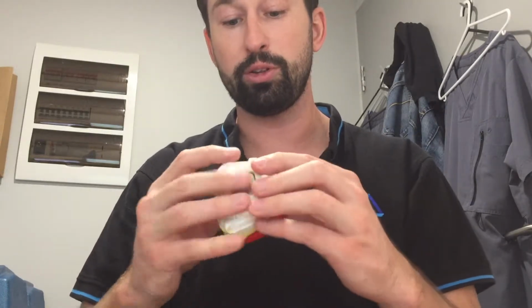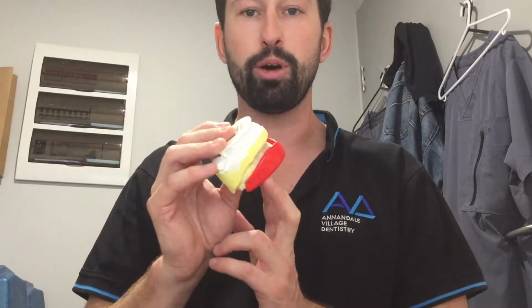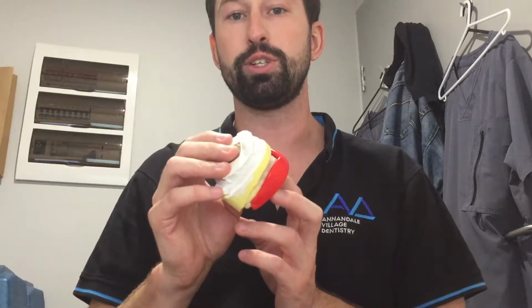Alright, so retention's great. Why is it so great? Well, it holds the mouthguard in place, which lets it do its job. If I'm running down the field, if I'm skating down the ice, whatever activity that you need a mouthguard for, the last thing you want to do is consciously have to be thinking about keeping your mouthguard in place. You don't want to think about it. You just want it to be there and for it to do its job. You don't think about a pair of gloves, you don't think about your helmet, and your mouthguard is a protective piece of equipment that you shouldn't have to think about at all either.